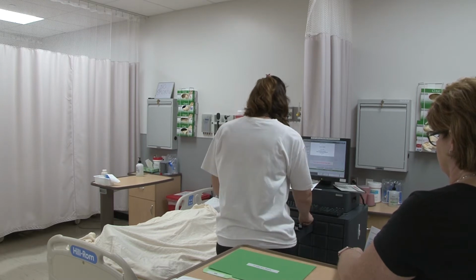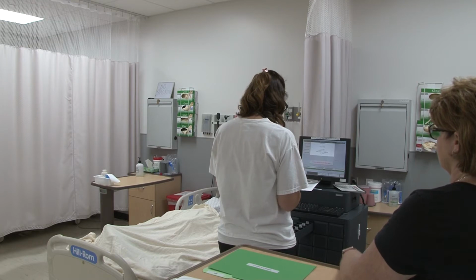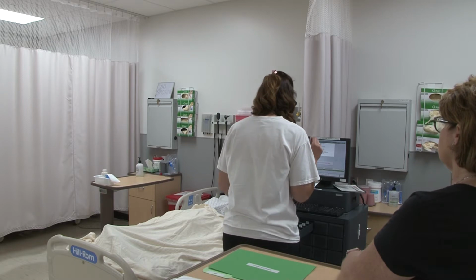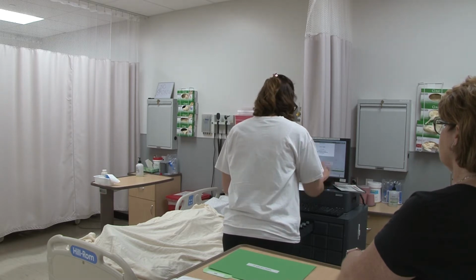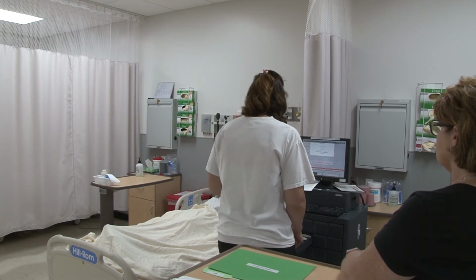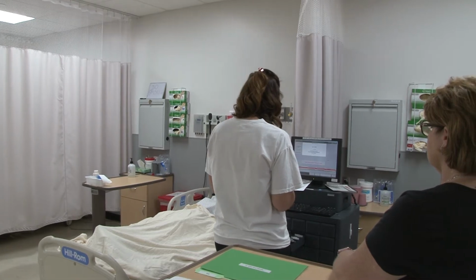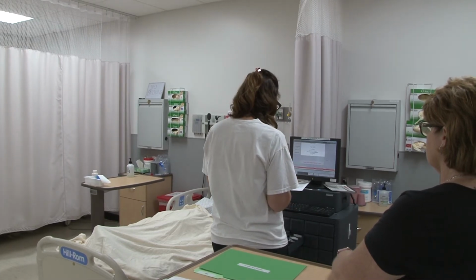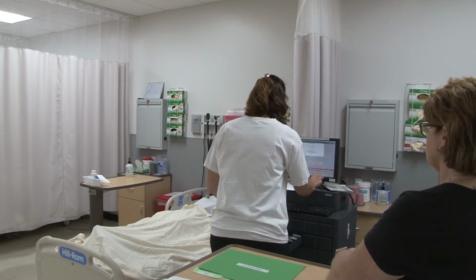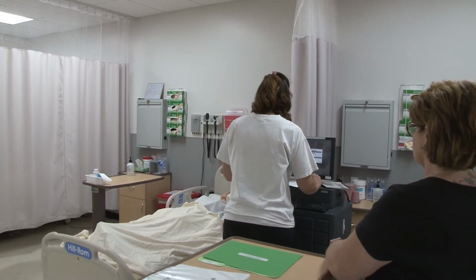Okay, drawer E. This is Cardi 120 milligrams, expires April 2020, and I'm going to be giving half of this for my 60 milligram dose. And Pred in section C. This is a 20 milligram tablet, so again I'm going to cut it in half to get my 10 milligram tablet. Expires June 2025. And those are the 2 meds I need. I'm going to log off.